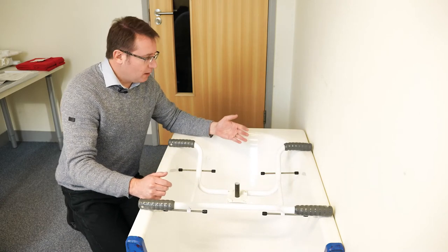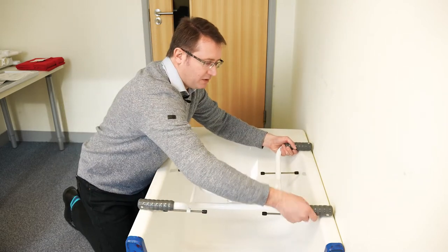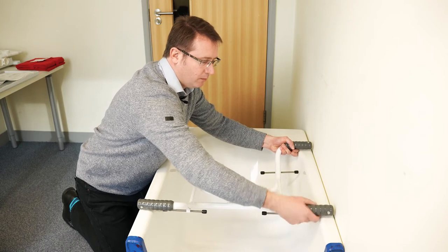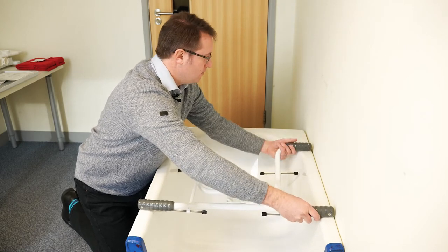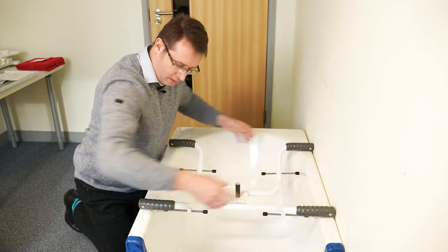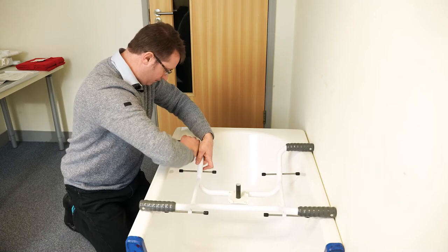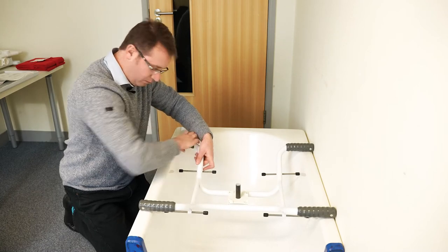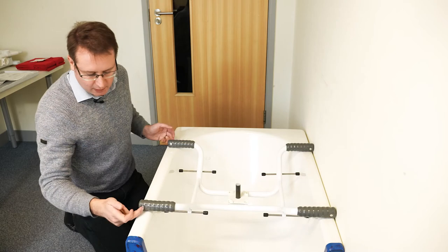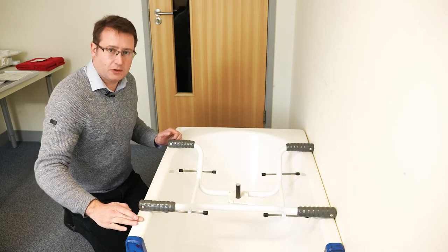I'm going to adjust out the end caps so that it fits the bath a little bit better, simply by screwing them out. I also like to have the rivets in a horizontal position so there's no chance of the rivet scratching the top of the bath surface.